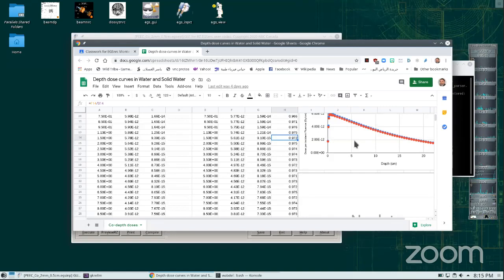But the density of those voxels is not going to be one, it's going to be like 2 or whatever, based on the CT numbers. Lung is the same thing. The treatment planning system assumes lung is water, but with a lower density, 0.3 or 0.26.